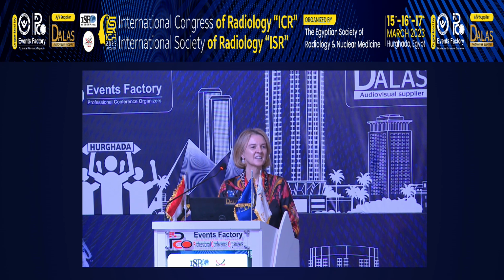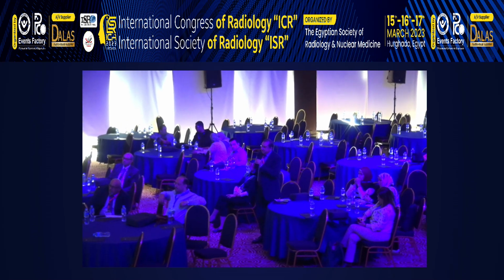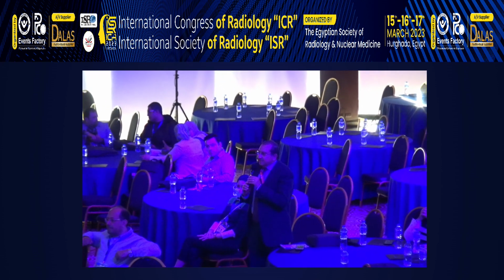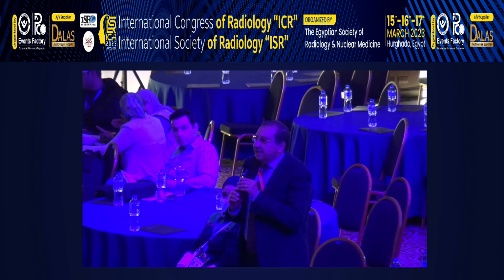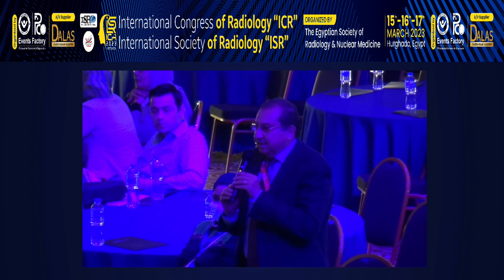Professor Bello, please. Thank you, Professor Bello, for the very nice presentation. I'm just asking about your cases number 6 and 7. In fact, they were totally different in the advanced MRI. They were different in perfusion. Case 6 was hypoperfused and with normal choline and NAA. Case 7 was the reverse. It was hyperperfused and the choline/creatine and choline/NAA ratios were high.